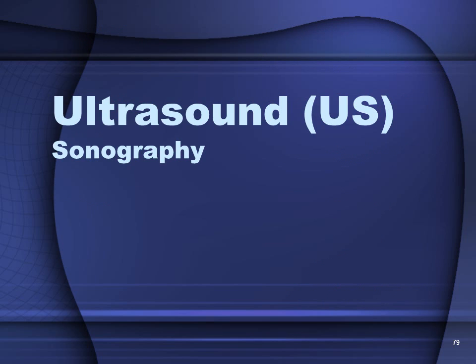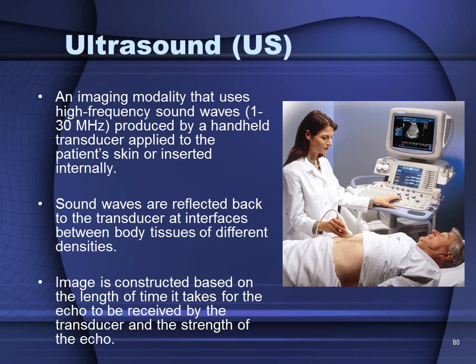Ultrasound or sonography is a technique that is increasingly being used in clinical medicine, and it is also encroaching on the research laboratory. Ultrasound technology utilizes high-frequency sound waves that are produced by a transducer, a handheld transducer that is held against the patient's body or skin. Occasionally, the transducer can also be inserted internally.